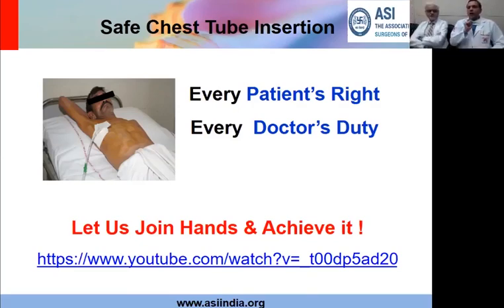Excellent question. If you are putting it for, say, a massive pleural effusion and the lung is collapsed, you know that the lung has already moved away from the chest wall and there is no need to put a finger there. But if the chest X-ray shows that the lung is still reaching up to the chest wall and you feel the lung could be adherent there, then there is no harm in putting the finger and doing some maneuver.